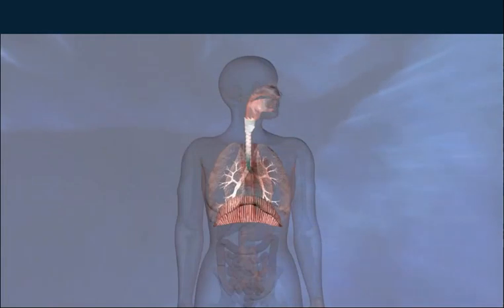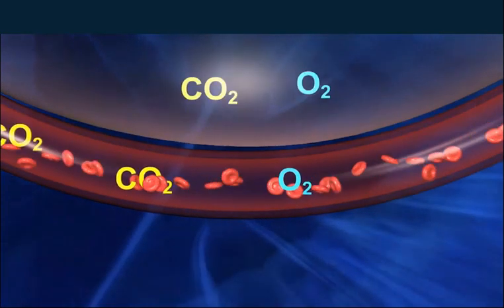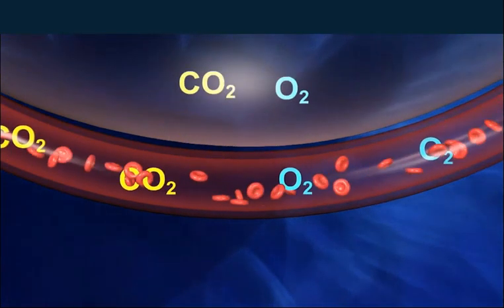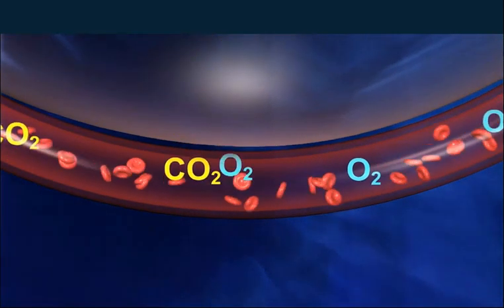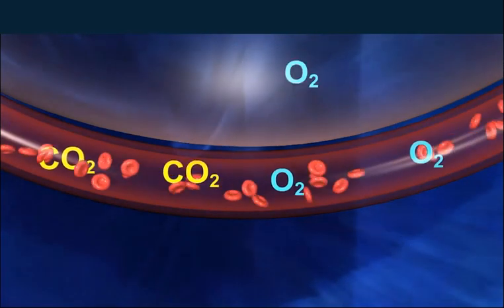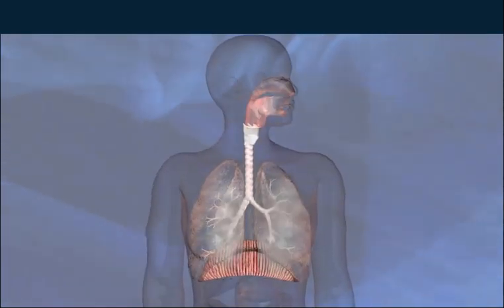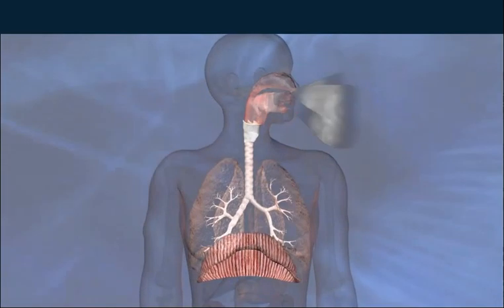Ventilation is the movement of air into or out of the lungs. The body regulates respiratory rate via chemoreceptors in the blood vessels that read carbon dioxide partial pressure levels. As PCO2 levels rise, the body increases the respiratory rate to blow off the excess.